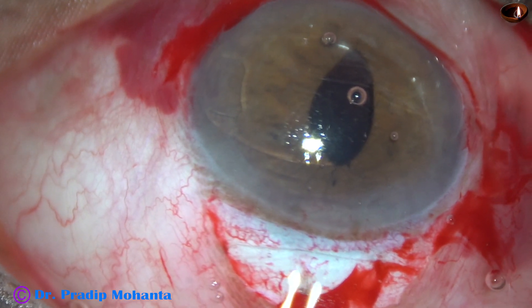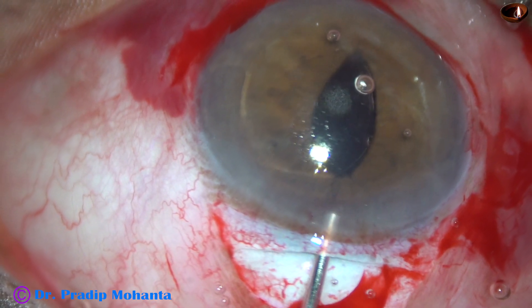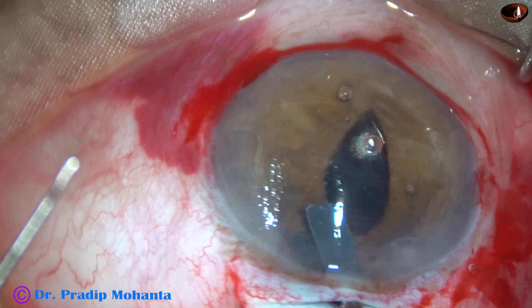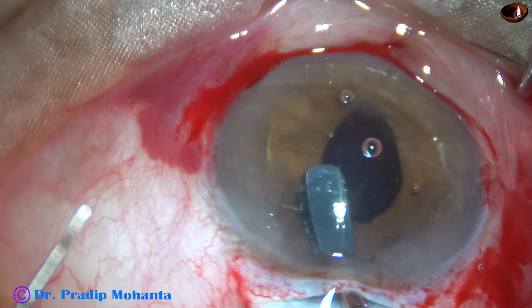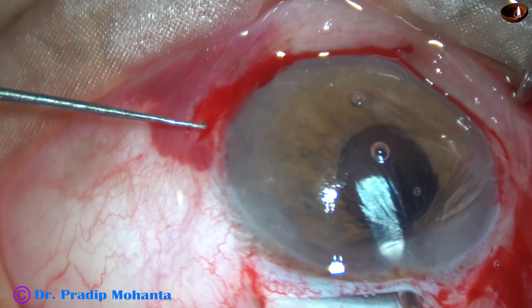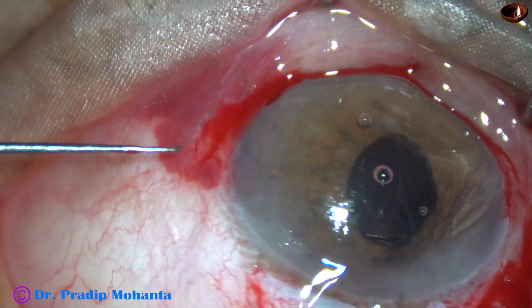Inject some more viscoelastic because the anterior chamber has become shallow by this time. And now I hold the lens with my dominant hand and get more control. And here it goes — enclaving the haptic at 3 o'clock. It is done.